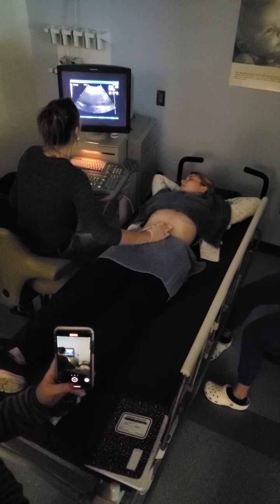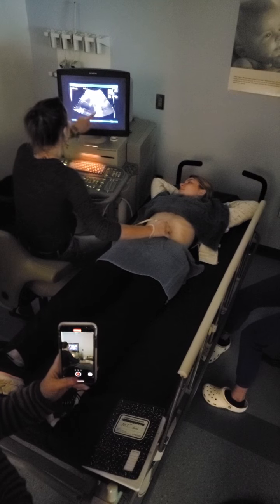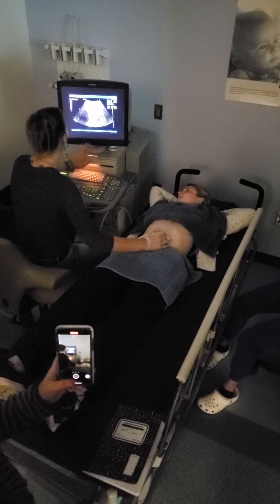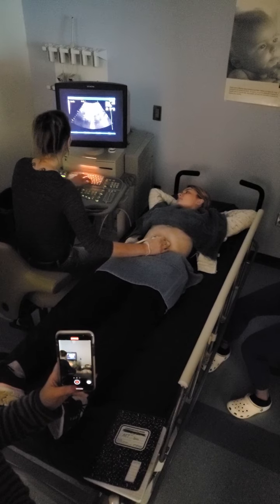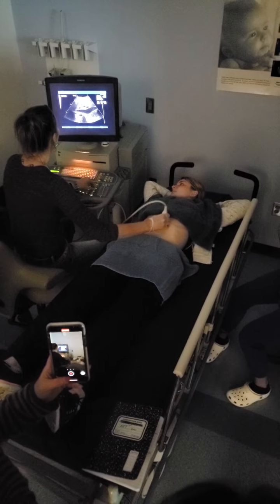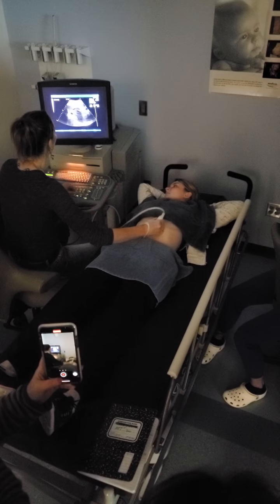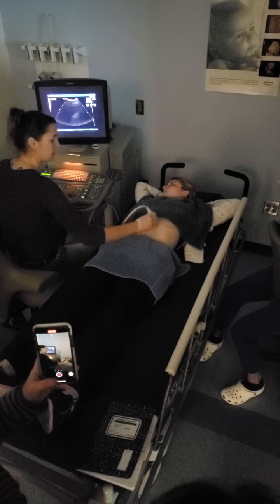So then we did all the way up at the dome. Came down to kind of vessel land, and eventually came down, here's our pancreas, came down to pancreas. So we took those three images. Then we moved to sag right liver lobe. We're gonna take those superior bordered images. So we did right off at IVC, we did a medial, a mid-medial, a mid-lateral, and a lateral. And we slid all the way down here.